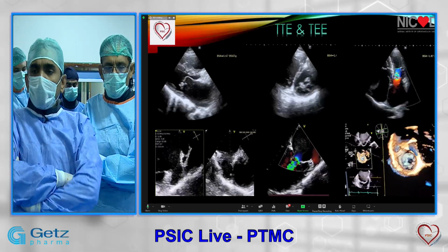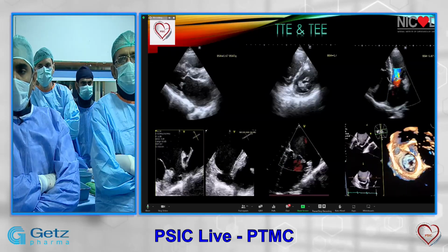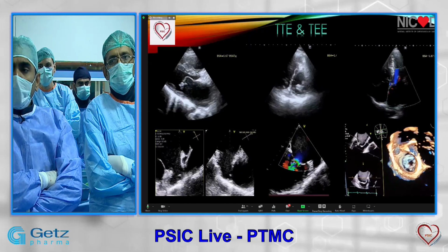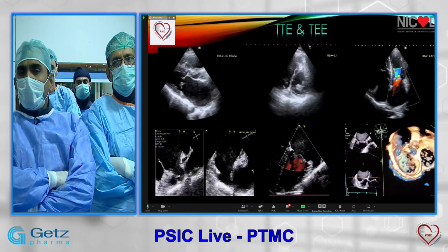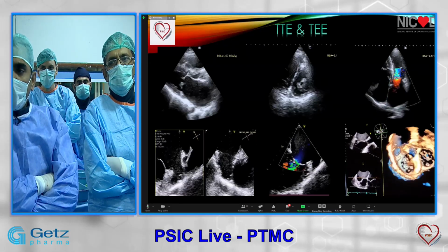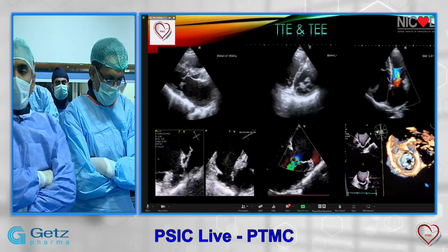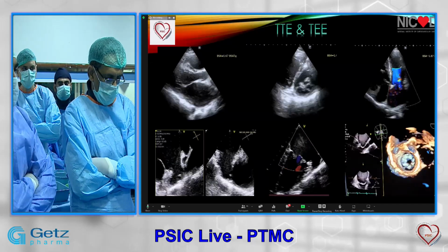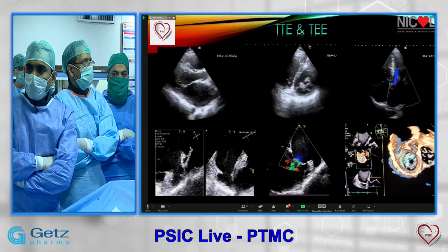These are the TEE images. There's no LA appendage thrombus and no MR. And in the last, you can see the 3D images. A very beautiful mitral valve is clearly seen with a small orifice in between. So I hand over the mic to Dr. Navidullah Khan for the procedure.